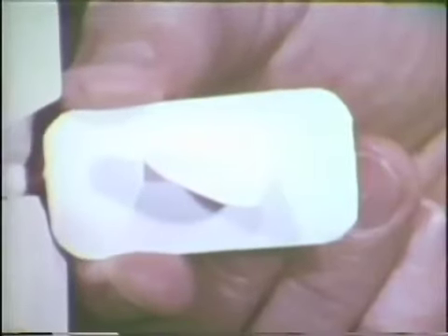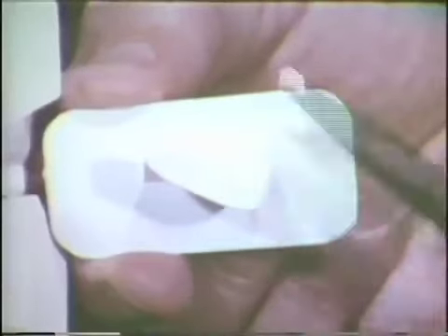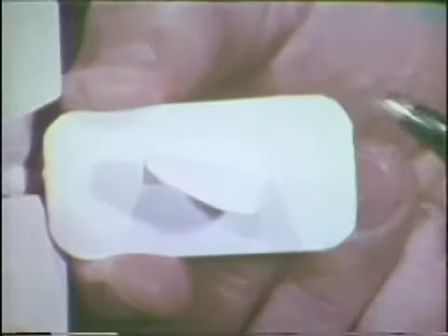After the exposure of the film and removal of the packet from the mouth, a check of the bite wing shows an oblique distortion with respect to the upper and lower edges of the film. The radiograph shows the result of such a displacement. The occlusal line of the teeth traverses the film diagonally. It provides abundant coverage of the lower molars, but severely restricts the coverage of the posterior maxillary segment. Anteriorly, the reverse is true. The remedy, of course, is to place the film lingual to the obstacle and not allow displacement to occur.